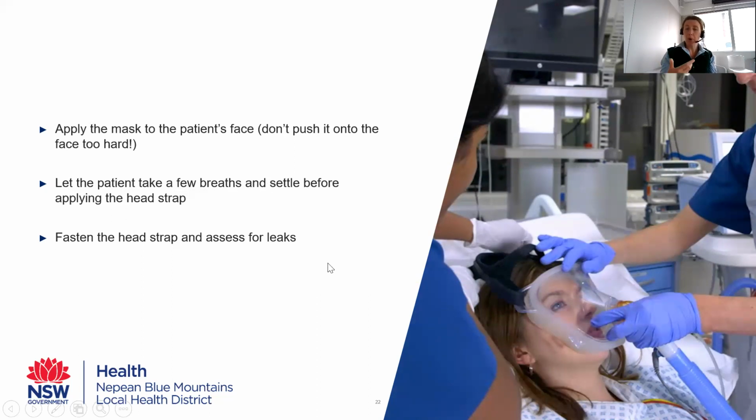Once you've got the head strap on, you want to assess for leaks. Now, different machines will cope with leaks differently. Some have really good leak compensation, some don't. Some leaks you can fix. So sometimes it's a mask size issue. You've got the wrong mask size. Sometimes you've got too much facial hair. Some leaks we can't do anything about.